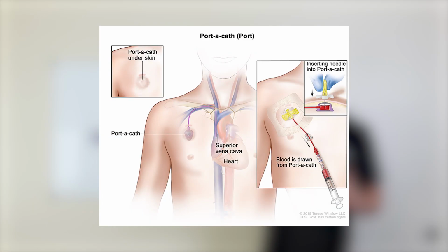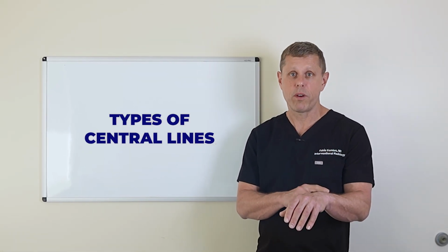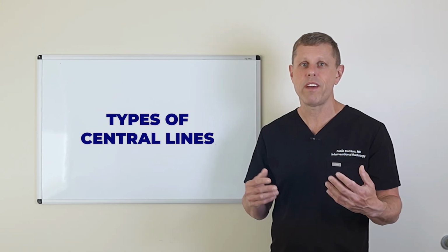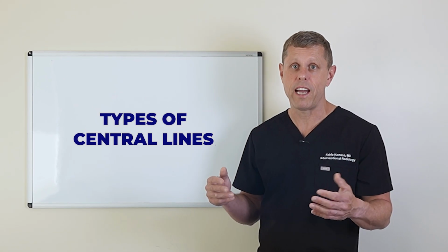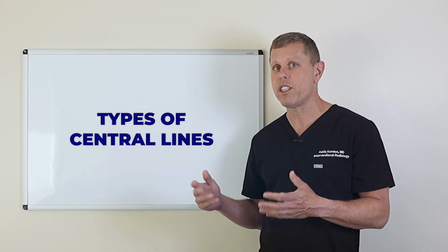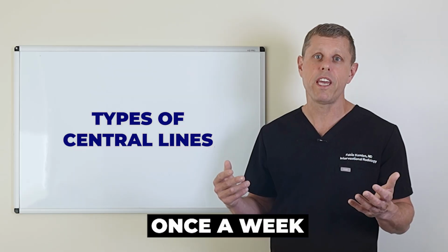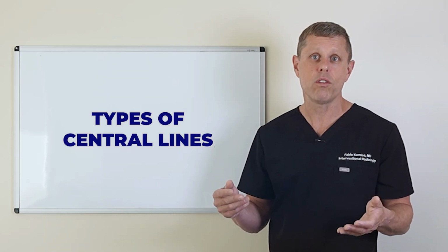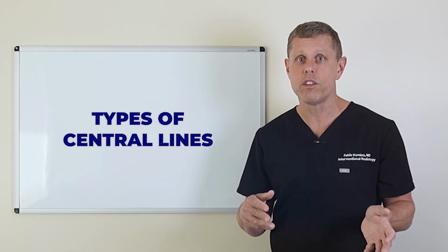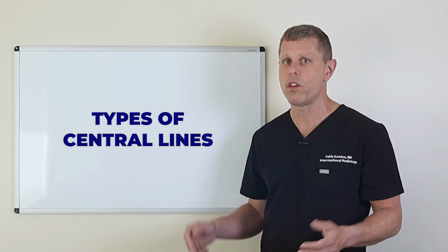Mediports are typically used for chemotherapy, for cancer patients. And like I mentioned before, chemotherapy can be very toxic to the peripheral veins and can destroy the veins. So in general, it's preferred to do chemotherapy through a central line, especially a port, because these patients don't need to use the line every day. They are usually using it once a week or every 2 or 3 weeks even. So whenever they have to use it, it's easy to just put a needle in, use it, then you take out the needle and you can go to the hot tub or swimming pool and you can do your normal activities.